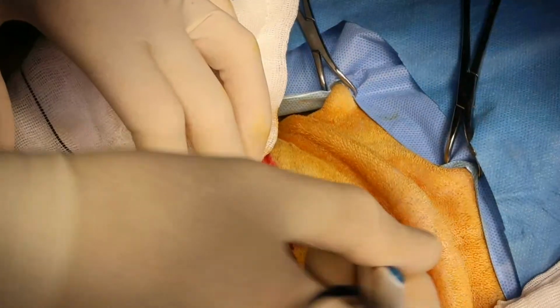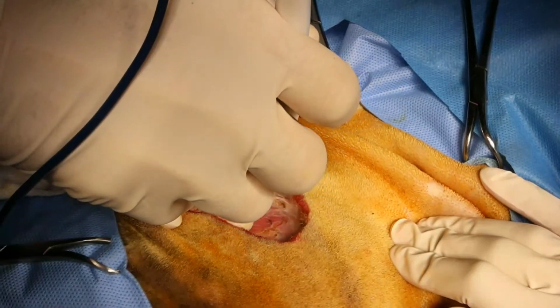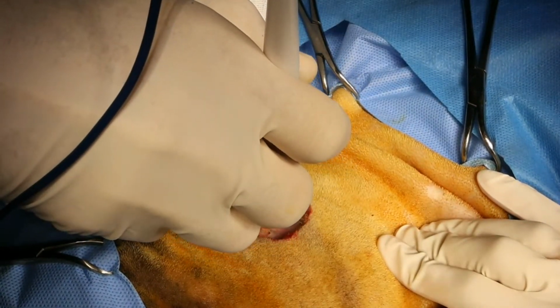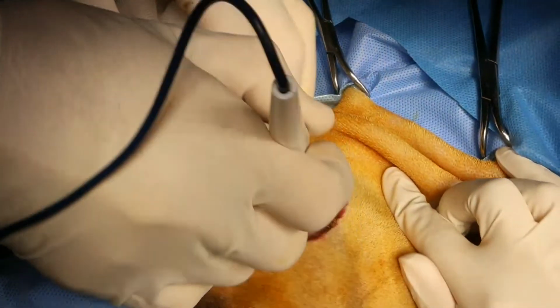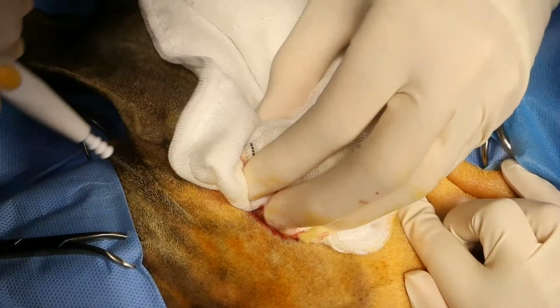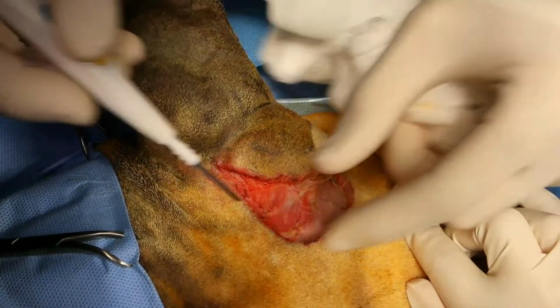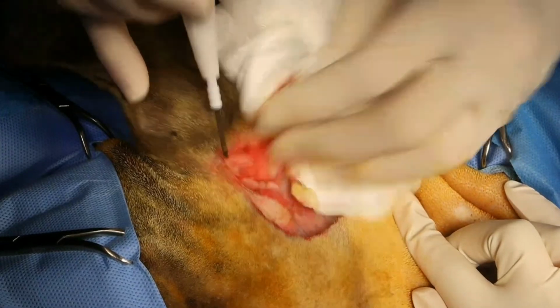Just give me some retraction back there. Go through these muscles here as well.